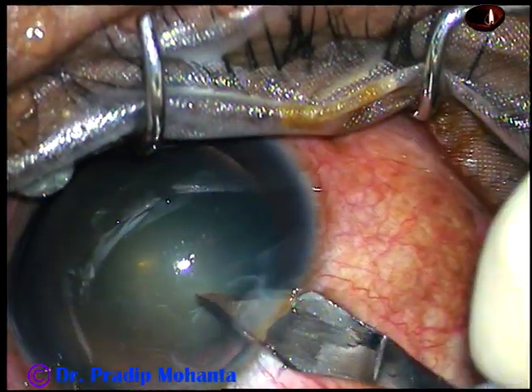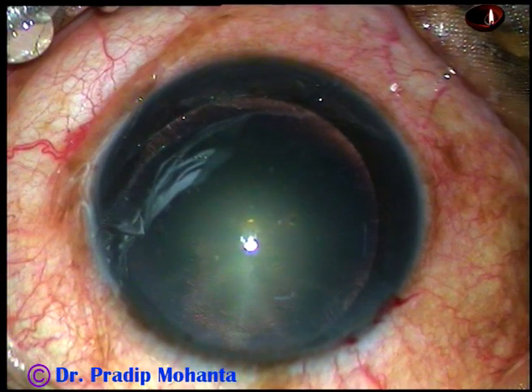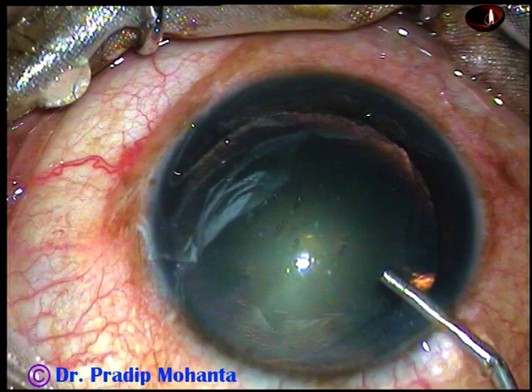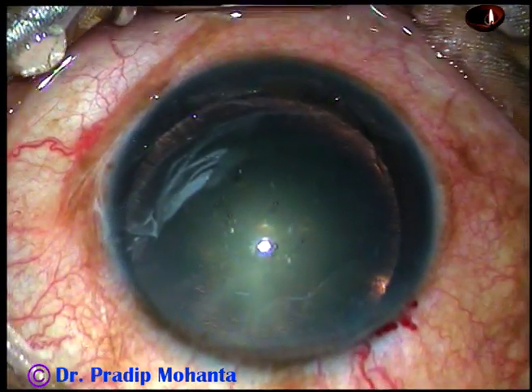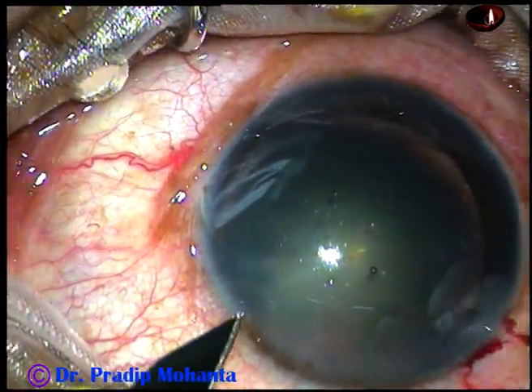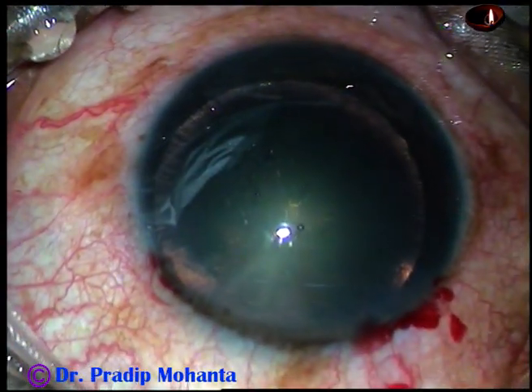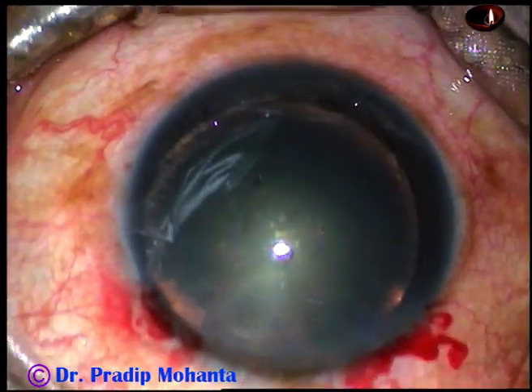Let us observe this surgery. This is the main incision on the posterior aspect of the limbus. And now the anterior chamber is filled up with 2% hydroxypropylmethylcellulose. A side port is made on the left side of the main incision, about 2.5 o'clock away from the main incision. Only one side port was made in this case.